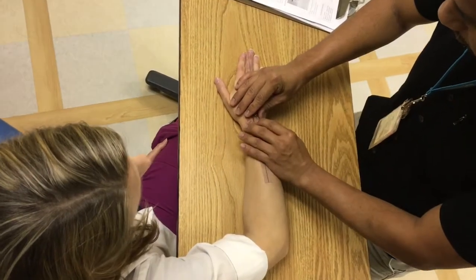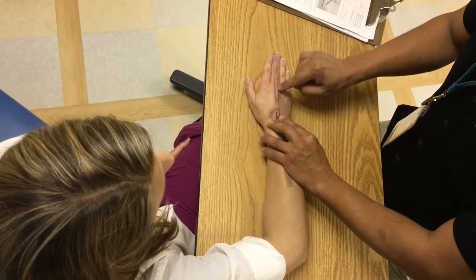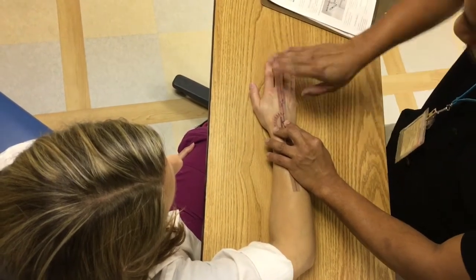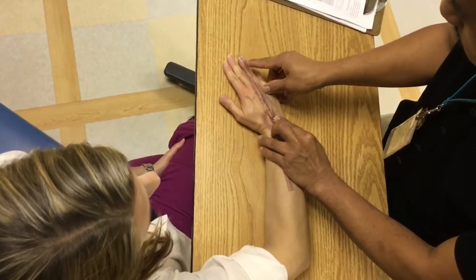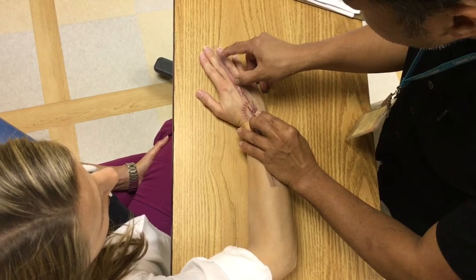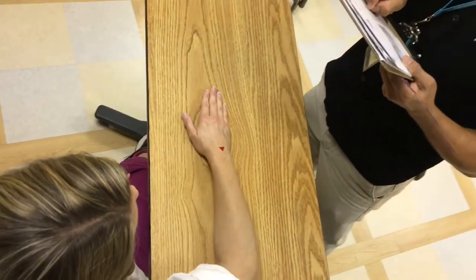Now for radial deviation. Align it on the lateral epicondyle, axis on the capitate, moving arm aligned on the third, the middle finger, the metacarpal rather. Okay, and then go ahead and move towards you, the wrist. As far as you can go. Okay, hold it. Okay, and relax. Thank you. That's about 20. Thank you.